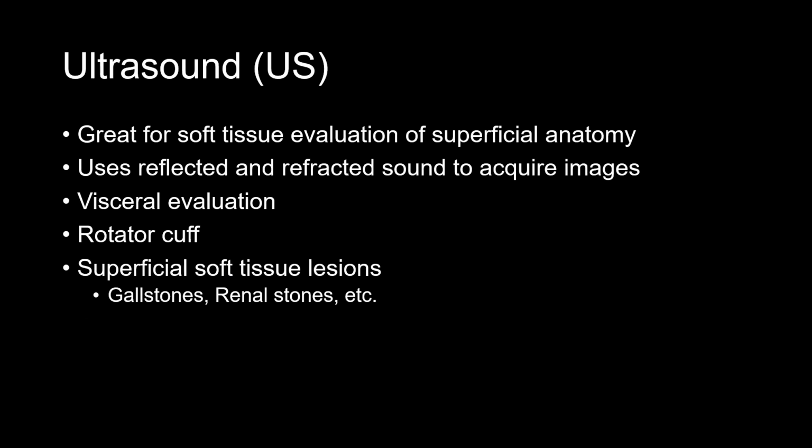Ultrasound is a modality that can be excellent for soft tissue evaluation, but it's limited to more superficial use because it functions by using essentially reflected sound waves, and the deeper within the body a specific part of anatomy that you're interested in looking at is, it'll be more difficult to get a clear picture. So if you have like a superficial tendon, like within a knee or a shoulder or a wrist, ultrasound can be great at evaluating that, and it also has the advantage of allowing you to evaluate motion or have these movies essentially to see how things are functioning.